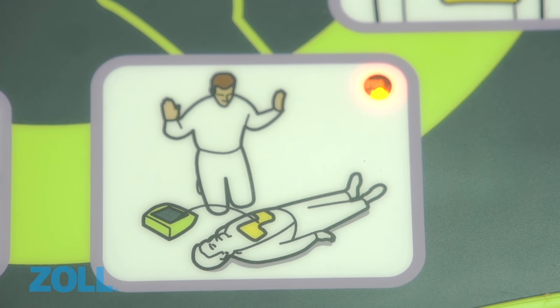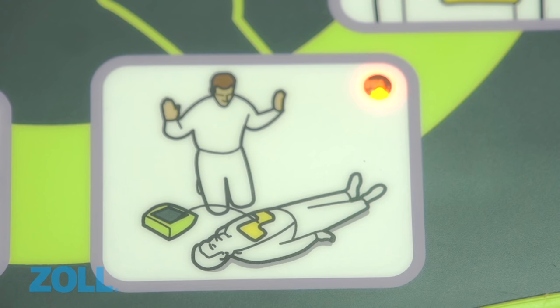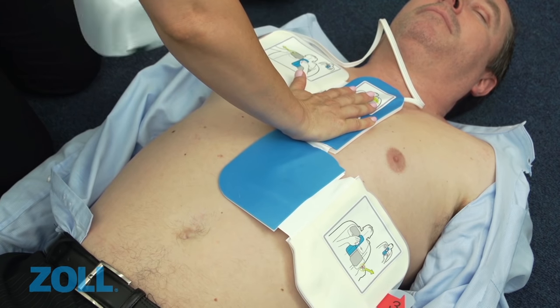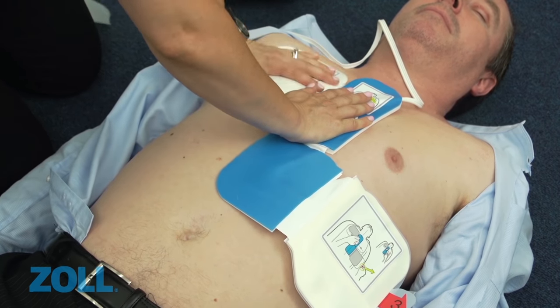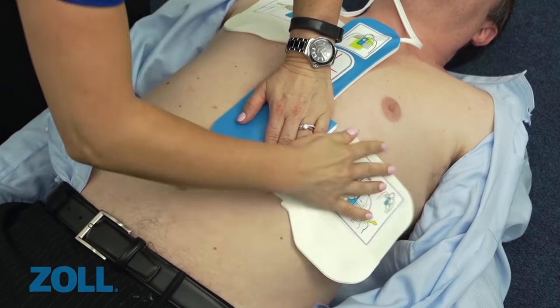Analyzing. You should not touch the patient at this point, and the AED Plus will remind you of this. Don't touch patient. Analyzing. In some situations, the early stages of the life support process may have been started before you arrive with the AED.